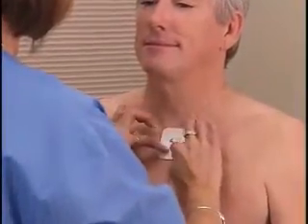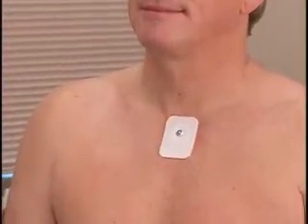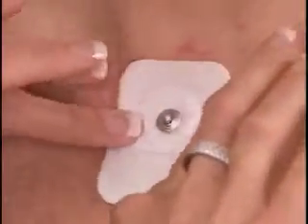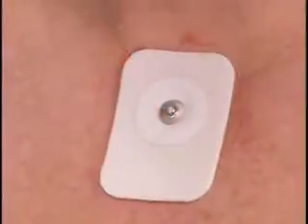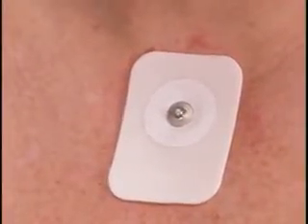Once you have placed the electrode, trace the outline of the electrode with your finger, making sure that the gel in the center of each electrode maintains contact with the skin surface. Also, make sure when placing the electrode that it does not wrinkle. Avoid pressing on the center of the electrode, as that may disrupt the gel and impede the conduction of the electrical impulses.